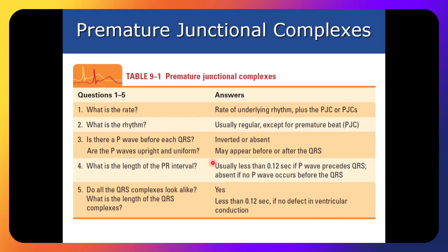But normally with a PAC, you will see the P wave, with the exception of one time when you would not see a P wave. When would that be? The interval's so short. And we would call that rhythm what? When our R-to-R intervals get really, really short, what do we call that rhythm? Generic overarching umbrella term. Tachycardia. Say it like you mean it. Tachycardia. So when our R-to-R intervals get closer together, we may not see that P wave.